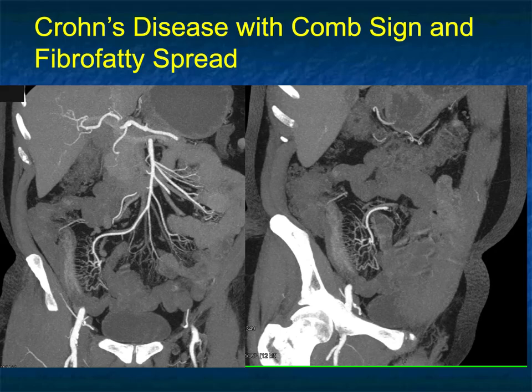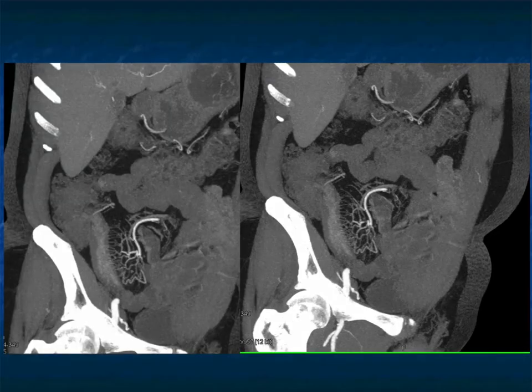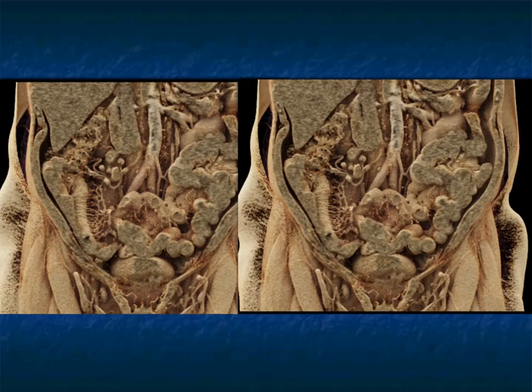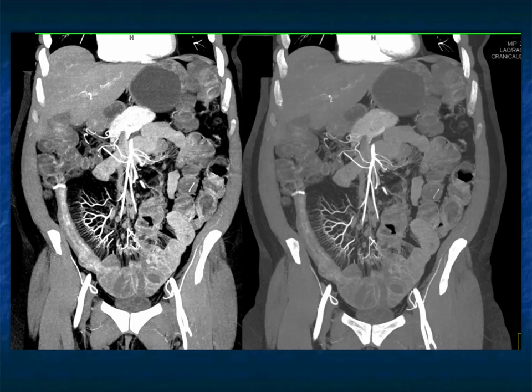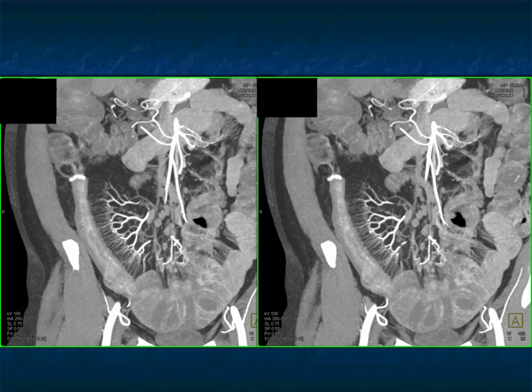Here's another example with fibro-fatty proliferation and the prominent vasa recta — the so-called comb sign. The vessels are all patent, but look at that branching of the distal ileal vessels, very nicely shown. And here it is with cinematic rendering, which really accentuates those vessels and the mapping of the vessels. Here's another example with a comb sign in Crohn's disease: terminal ileum wall thickening, hyperemia, prominent vasa recta, fibro-fatty proliferation — all of the various findings that allow you to be very specific for Crohn's disease.